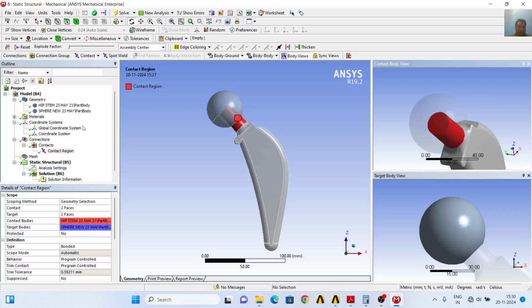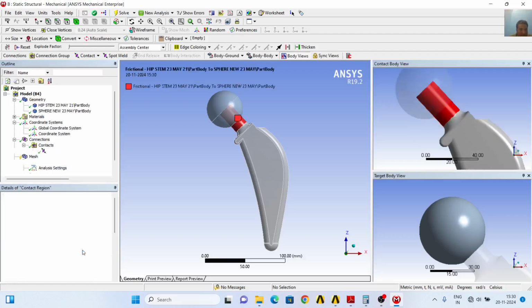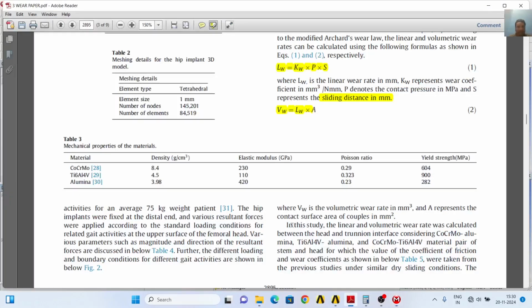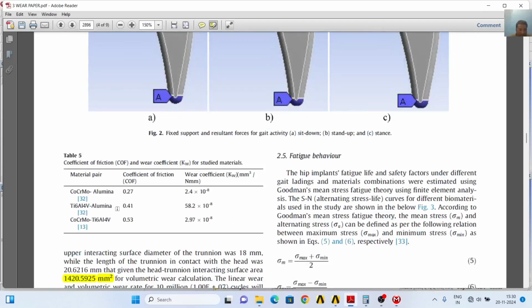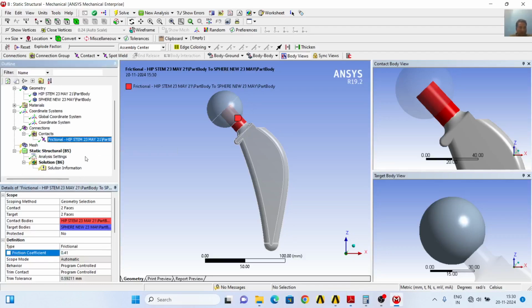Okay, so we will define the contact region, and here we will set this type to frictional, and we will give here the coefficient of friction between titanium and alumina. The coefficient of friction between titanium and alumina is 0.41. So we will give here the coefficient of friction as 0.41. Okay, and now you are done.